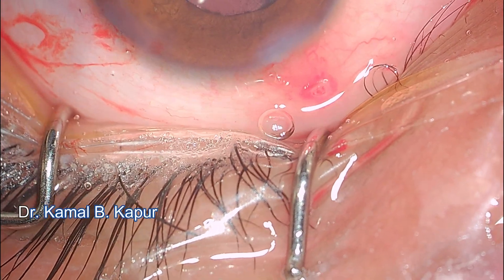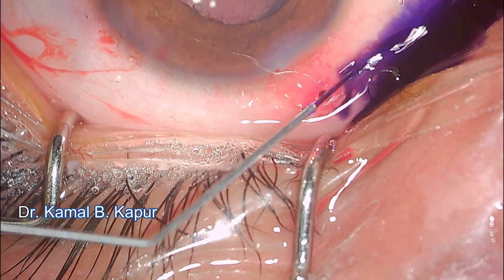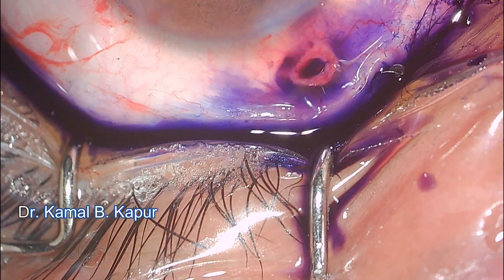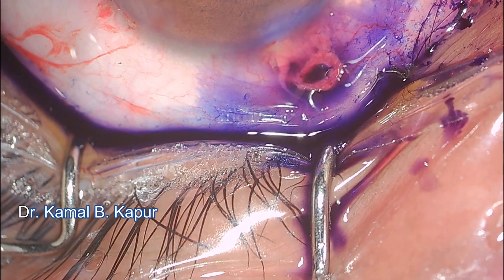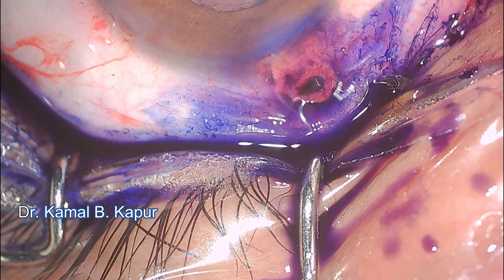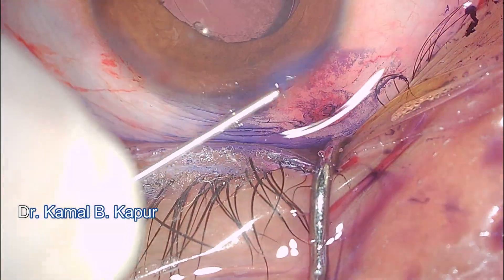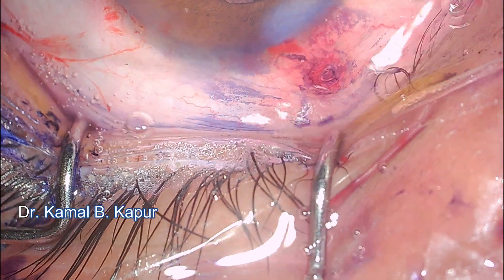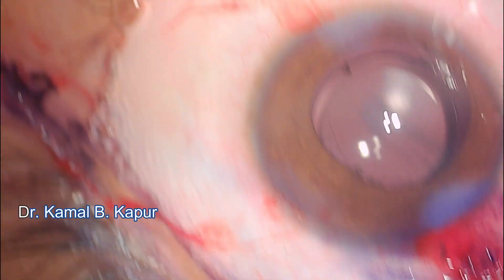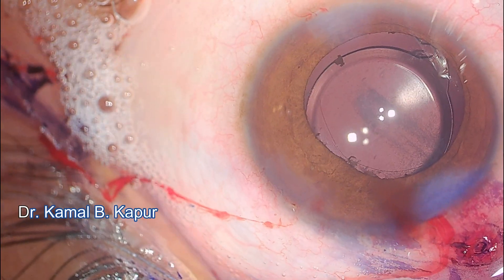To check for any leak, a modified Seidel test is performed by instilling trypan blue in that area. If leakage is occurring, it's important to do this test before closing the lesion after foreign body removal. The same test can identify leaky wounds in cases of wound burn or irregular cataract surgery. It works like a Seidel test — confirmed no leak, and the eye is absolutely normal. This patient did very well, and the YAG capsulotomy was done after eight weeks with an excellent outcome.